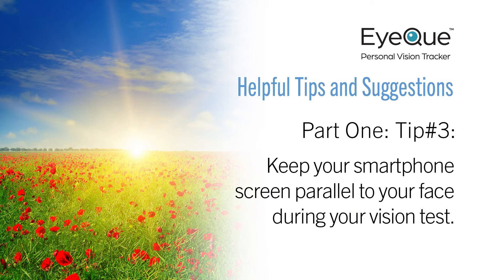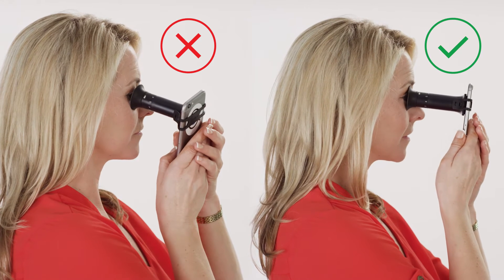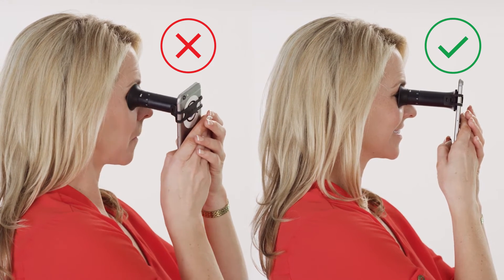Here's another simple tip. It's important to keep your smartphone parallel to your face during your vision test. Holding it at an angle will cause incorrect test results, especially for those with astigmatism.